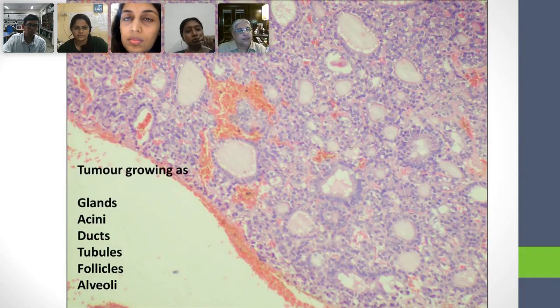Excellent. So tell me, what is an acinus if you know it? You mean the pancreas has got grape-like structures with or without a lumen? What is the function of the acinus in the pancreas, or for that matter in the salivary gland? What is the function? Secretion. So it may or may not have a lumen. I find that very interesting, because if there is a secretion... No, ma'am, it has to have a lumen. Oh, it has to have a lumen.